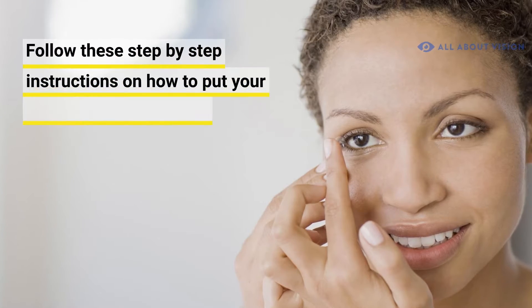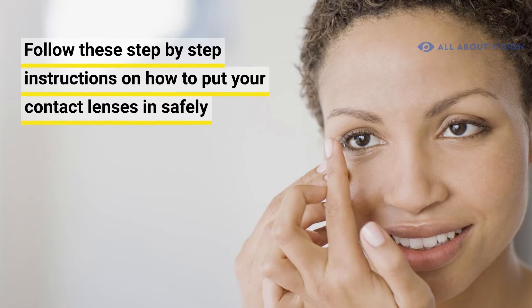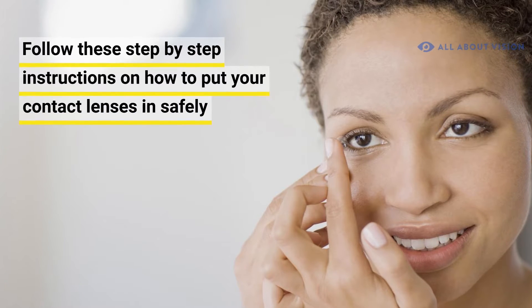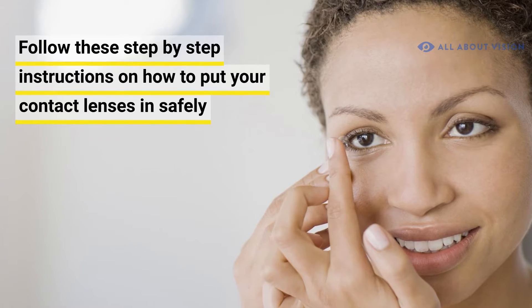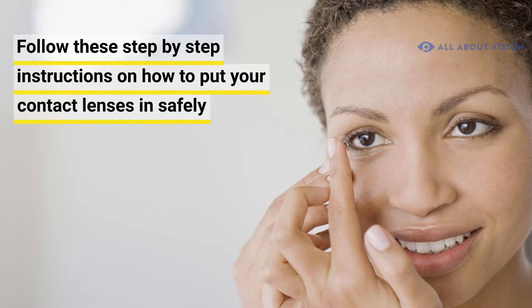Wearing contact lenses can seem overwhelming in the beginning, especially when it comes to putting them in. But don't worry, just follow these step-by-step instructions on how to put your contact lenses in safely.